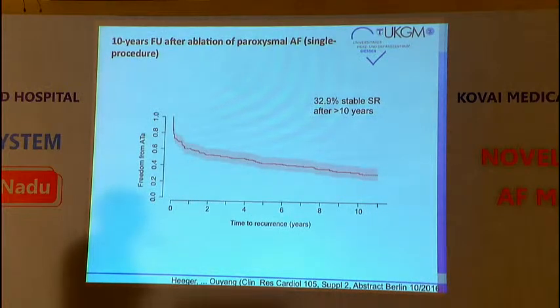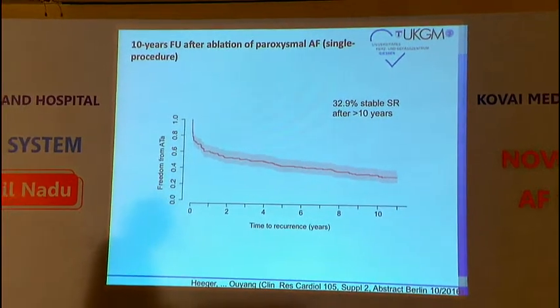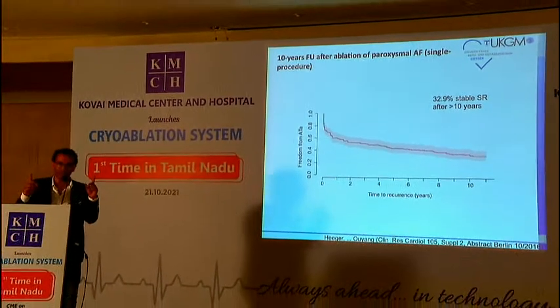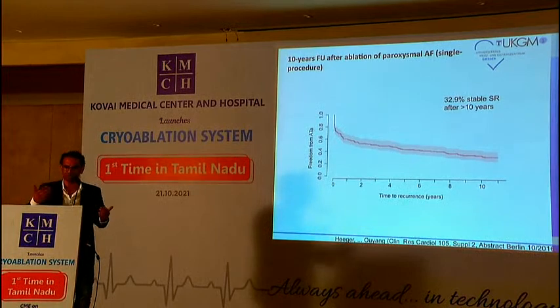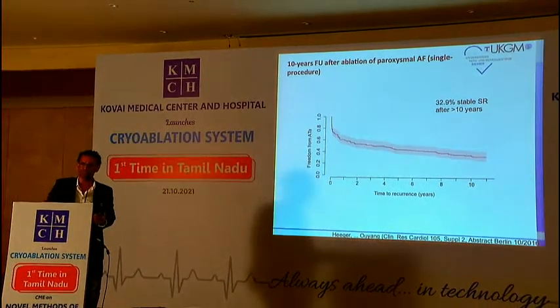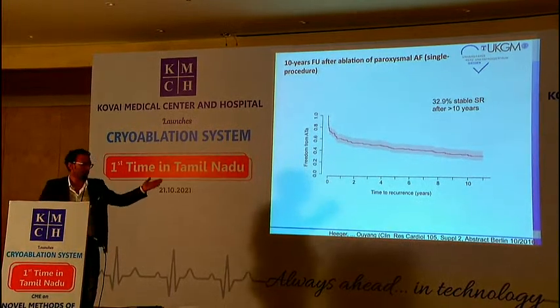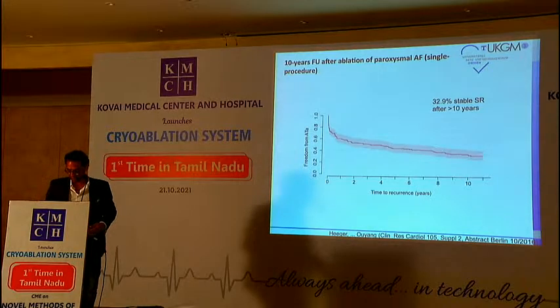And if you look at the long term, with one procedure, only 30% after 10 years. Just think about 10 years. We have now the year 2021. We started on a routine basis with catheter ablation, PVI, maybe 2008. So there are not too many long-term follow-up data.